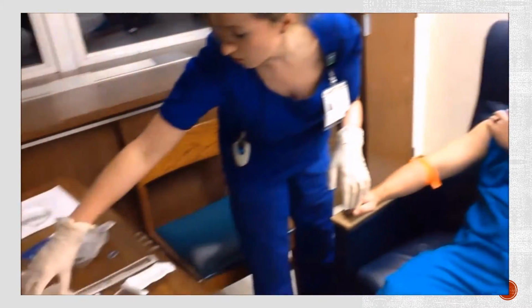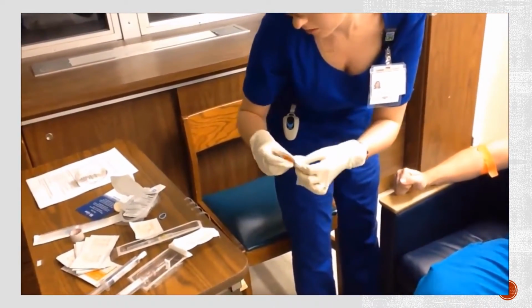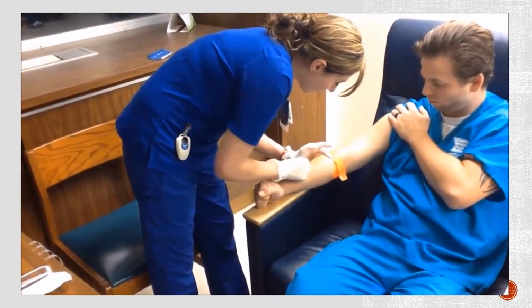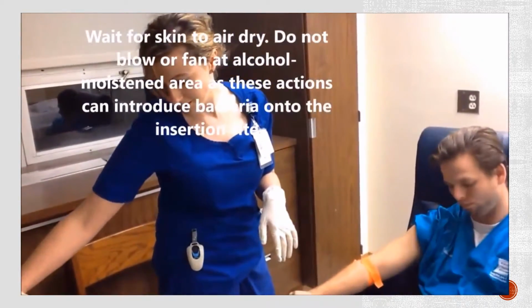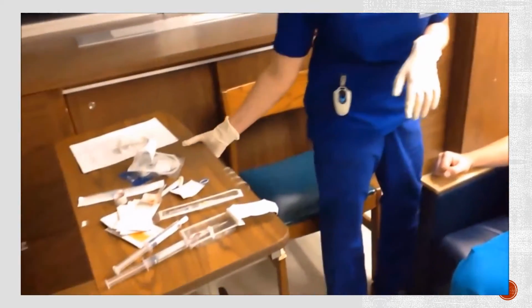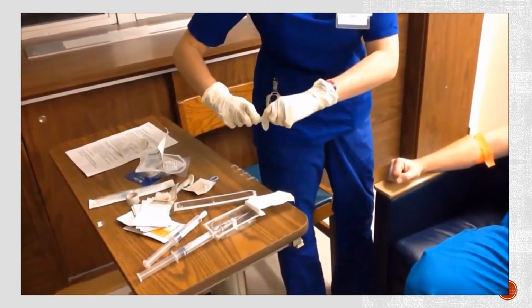What you're going to do is you're going to clean from inside to out in a circular motion with an antiseptic wipe. And you're going to let that dry completely for a minute. And meanwhile, I'm going to get my stuff ready. Okay. Alright, minute has passed.